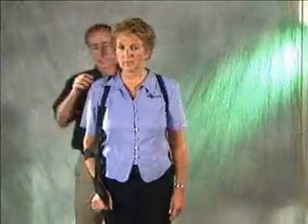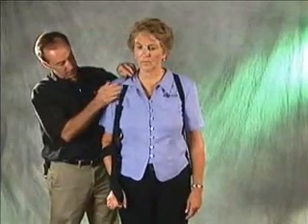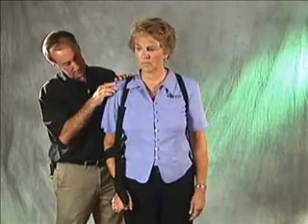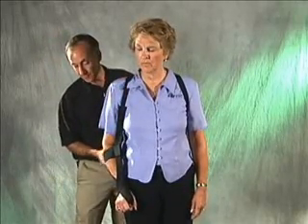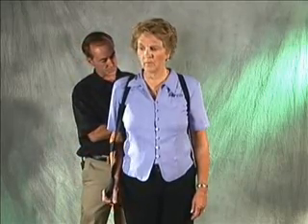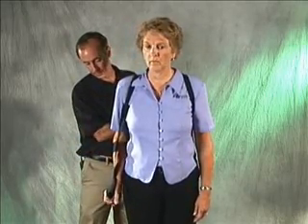Once you have the sling on, you can adjust the sling to reduce the subluxation. We can then adjust the tension — we want to reduce the subluxation by tightening the anterior and posterior straps. This is looking pretty good right here. Now, notice the client is in a little bit of internal rotation. You can reduce that by tightening the posterior strap relative to the anterior strap.